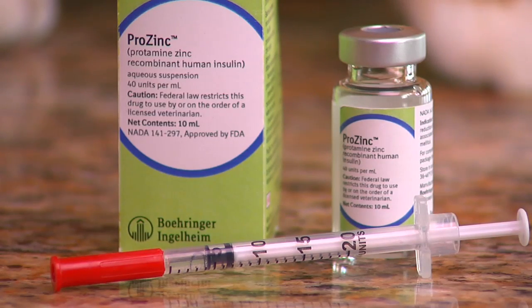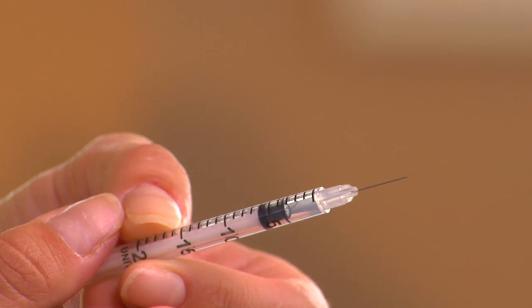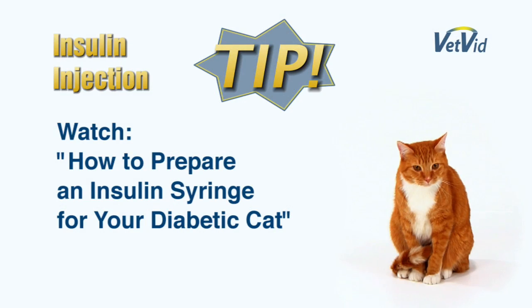Lisa has already filled the syringe with Frankie's correct dose. For more information on preparing your syringe, you can watch our VetVid video, "How to Prepare an Insulin Syringe for Your Diabetic Cat."